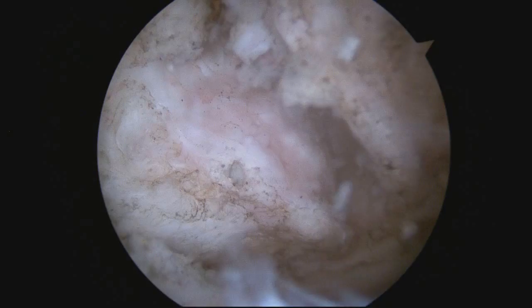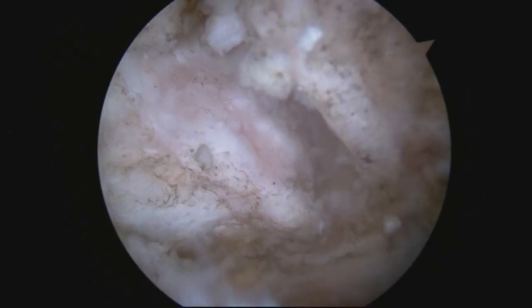You can see it moving. You can see there's a lot of arthritis there — instead of a nice, white, smooth cartilage surface, it's all hilly and bumpy and jagged and irregular. That causes a lot of pain.